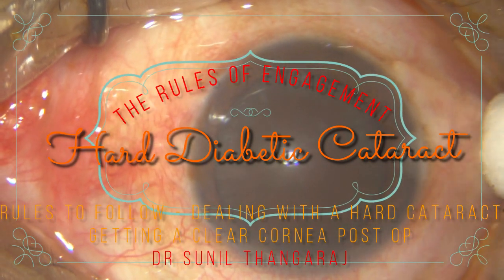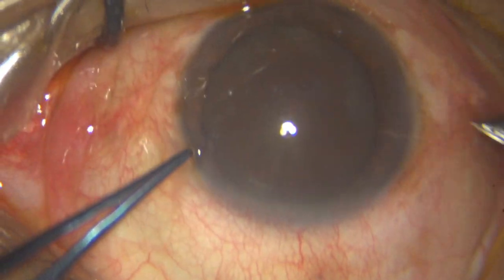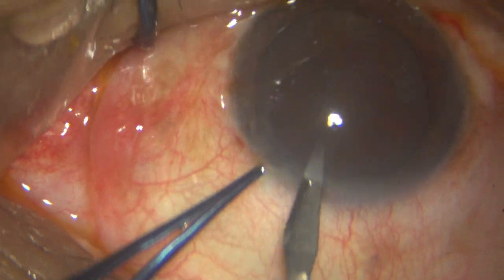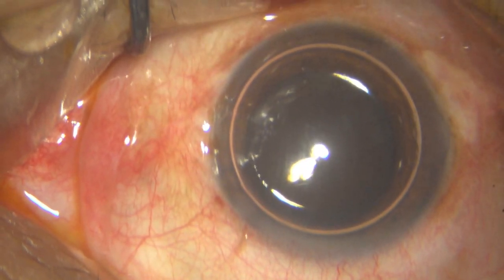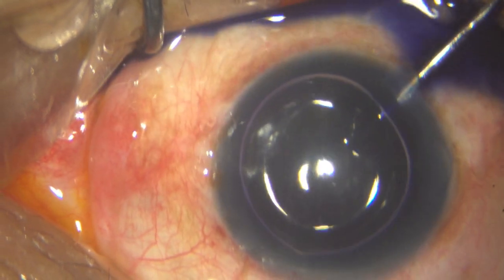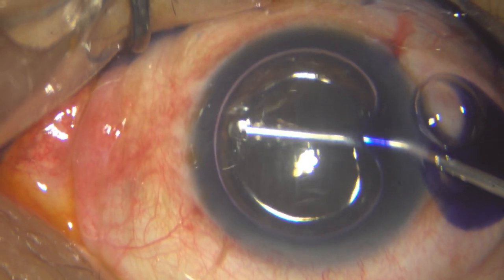Now this is about dealing with a hard diabetic cataract. I am going to point out certain rules. The first thing, you have to have an adequate block and proper incisions, even if you're doing under topical. The next rule, I think, is you always have to have adequate dilation and you should stay in the capsule.